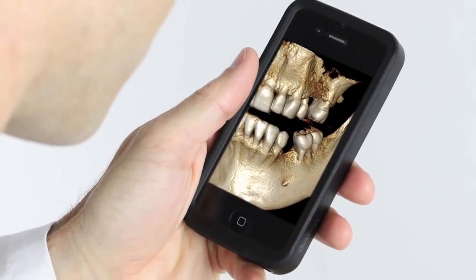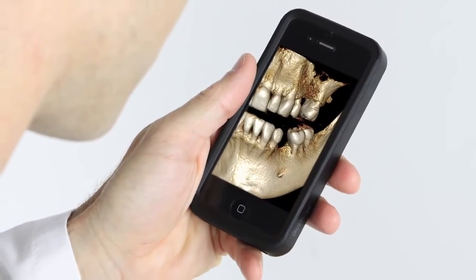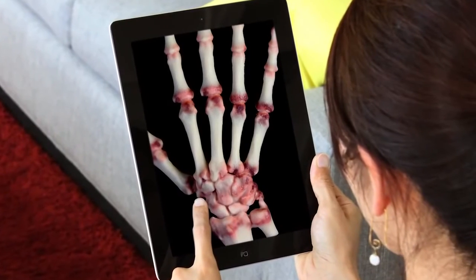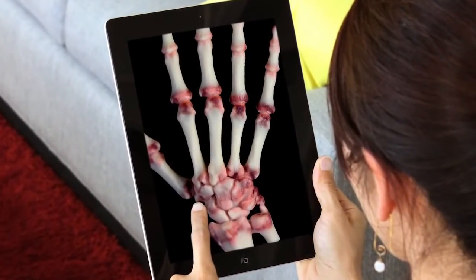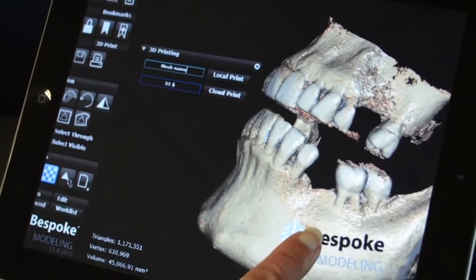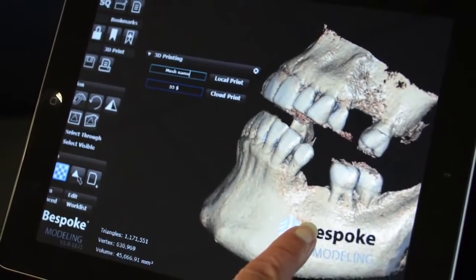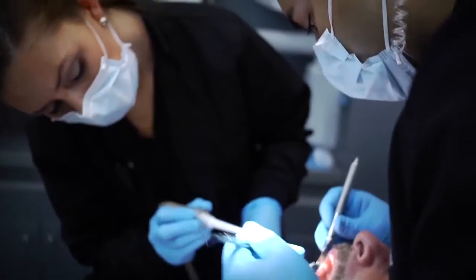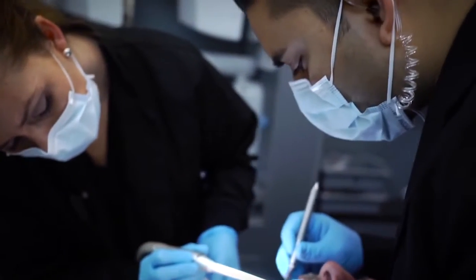Bespoke Modeling works on all internet browsers and iPhone, iPad, and Android mobile devices, allowing you to share images directly with doctors and patients.